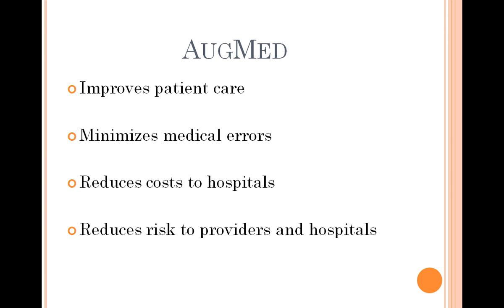AugMed is a medical tool that creates an augmented reality to visualize electronic information. It overlays text onto reality, allowing for the two to appear in the same frame. The text it overlays is obtained from a database, and all the data is set by a healthcare provider.